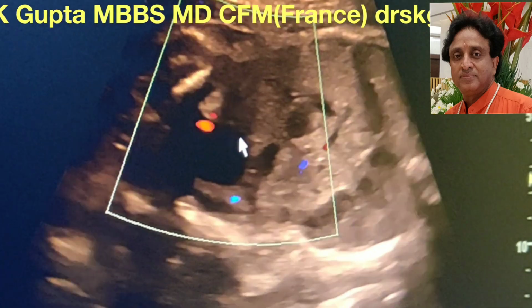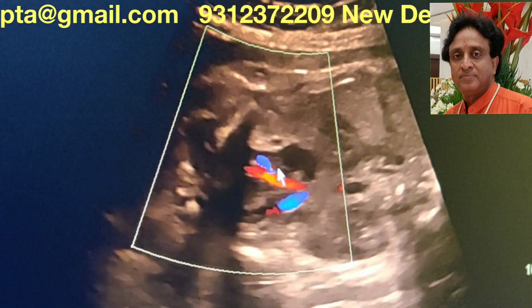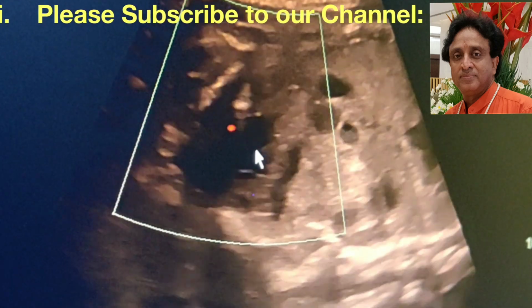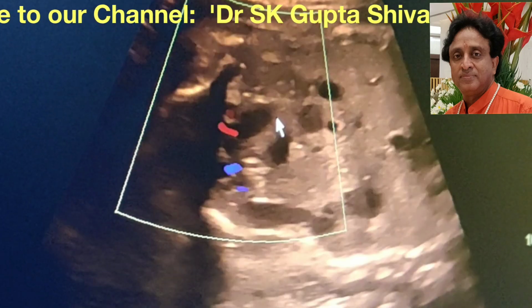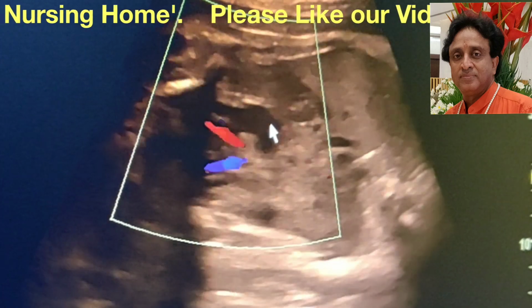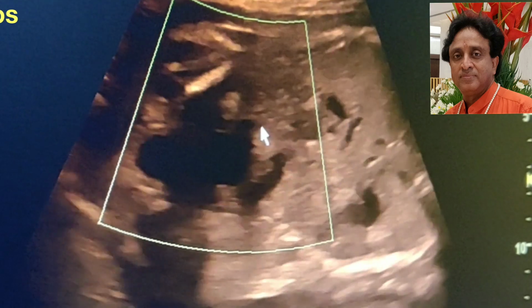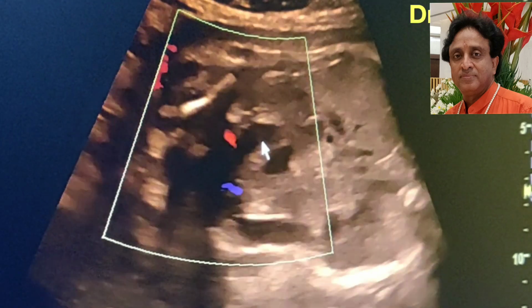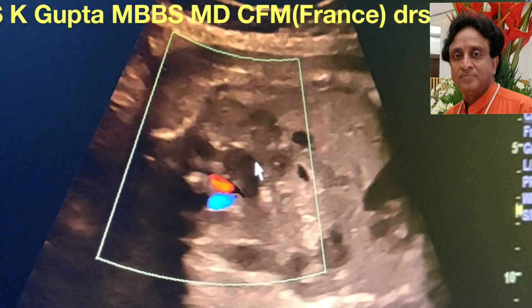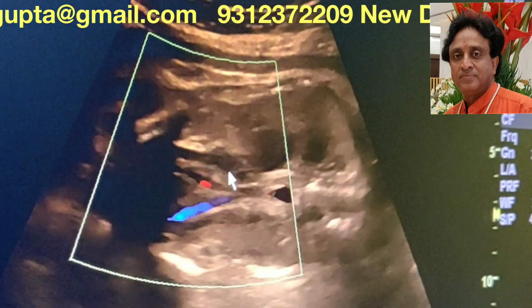I'm trying to show you, maybe, that this is the ureter, the dilated ureter. If I can follow it up, or it is the intestine, difficult to say, but there is some structure which is slightly dilated and connecting with, most probably it is the ureter which is dilated and going up to the kidney. Let me try to follow it.